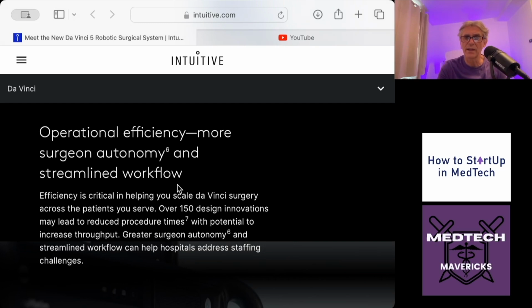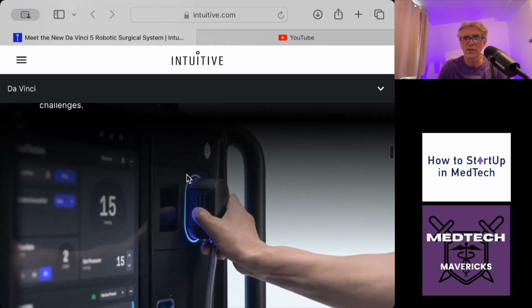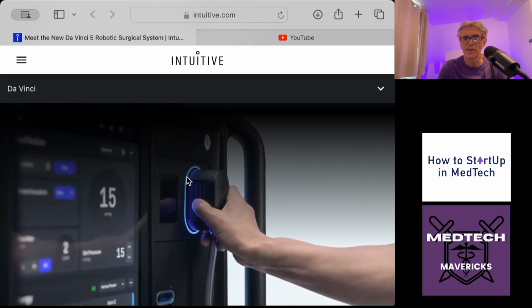They really dig into the workflow here, and I can't stress this enough. This is the insufflator, and it's a single piece that clicks in, which is clever because they're not going to charge you a pay per click for the use in laparoscopy, but if you're going to do laparoscopy and use their insufflator, you are going to buy maybe $100 of consumable there. This is a consumable piece. It's got filters in it. It allows gas to come in. It allows gas to come out.